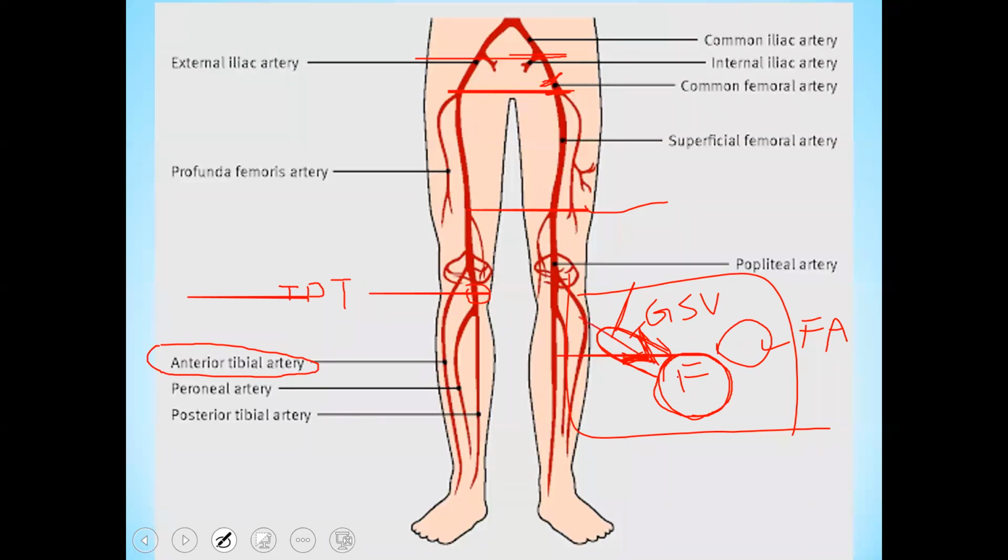It permits blood flow only in this direction and prevents its backward flow. But in cases of any incompetency, the blood can flow in the reverse order, and that will be a sign of venous insufficiency. So first of all, you should interrogate this saphenofemoral junction for any signs of incompetency.